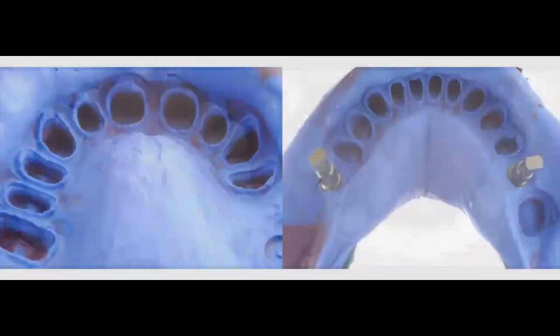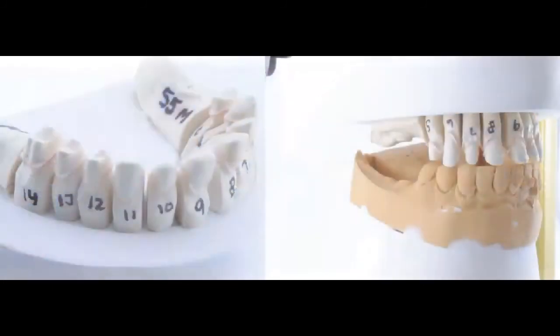So for that specific case, what we're doing here is that now we got our final impression, and once we get our final impression, we mount our cast. I'm not going to go through that, but you all know that this needs to be done and how it's done. Now you can see that I have my upper cast fabricated against my temporaries on the lower. You can see this is now all the restorations.